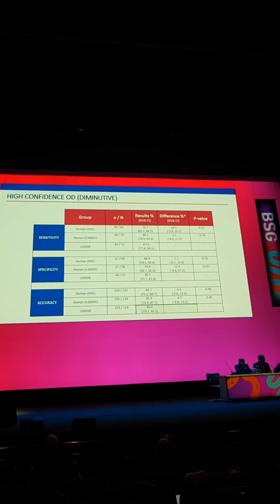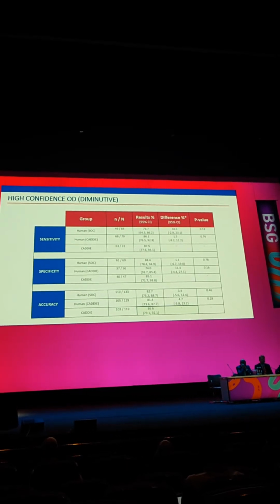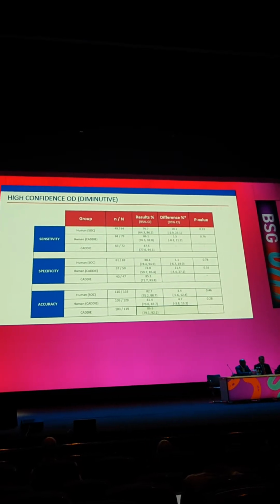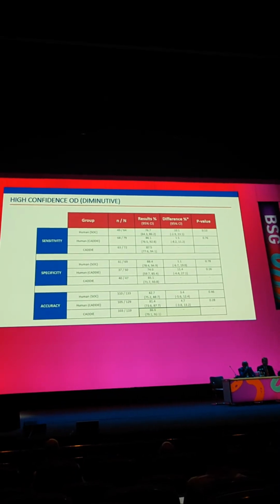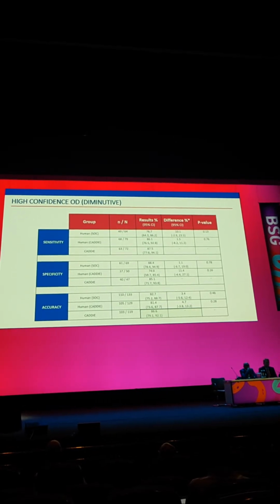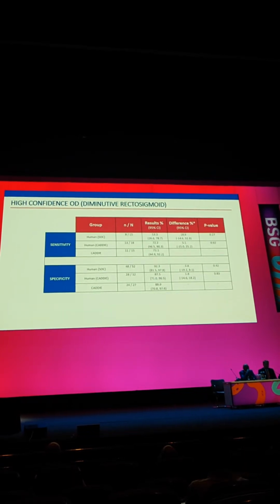And so what this means is that in terms of overall accuracy, we're not actually seeing much improvement or any improvement at all in the performance of these non-expert endoscopists when they're using the CADx system. And what's most alarming about this is the fact that the CADx system is actually performing quite robustly. We have an accuracy of 87%, and what's happened with humans is we're lowering that performance threshold.